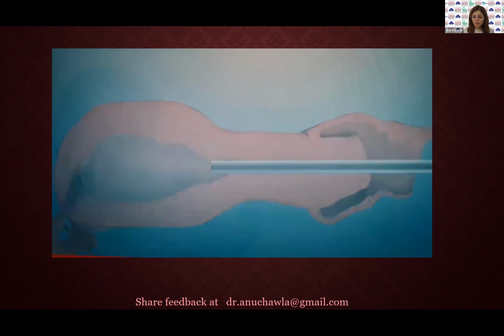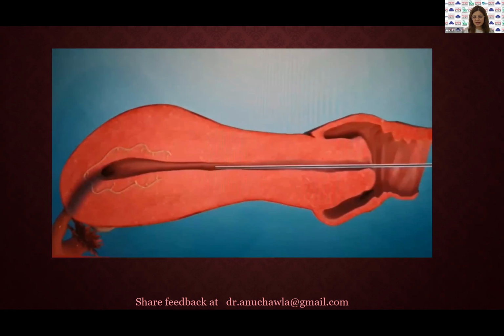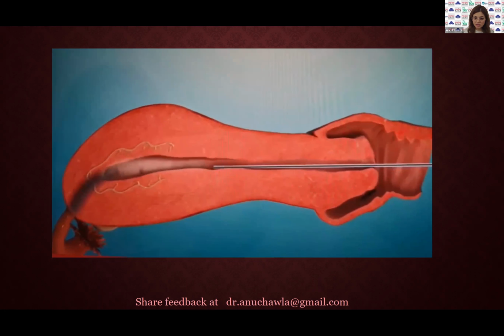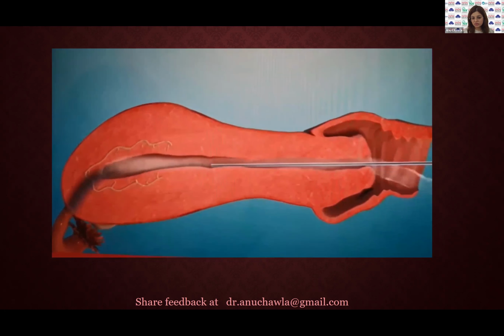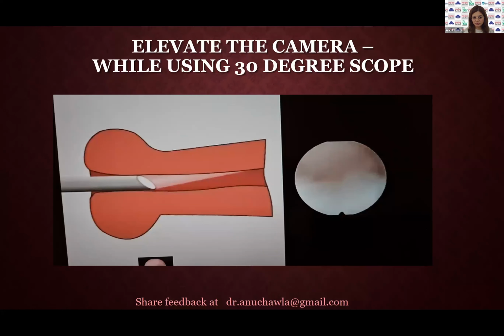When we choose the diameter carefully, when it is not very thick and not completely occluding the canal, then the pain is less. You can take those 15 minutes to actually complete your procedure, and then the time of this procedure is the key to the success. That will avoid you going in the OR for a repeat procedure.